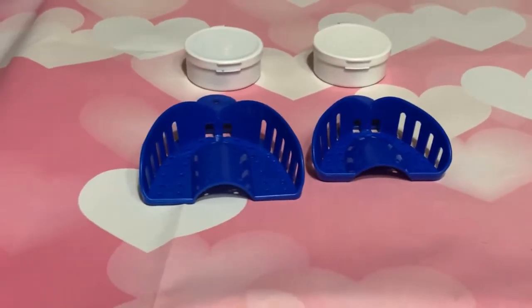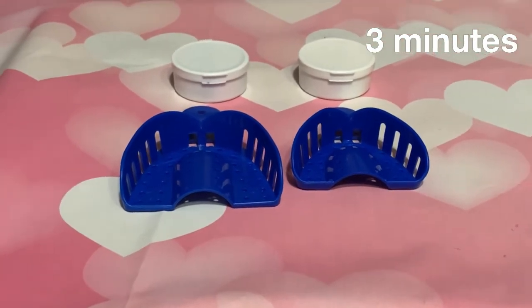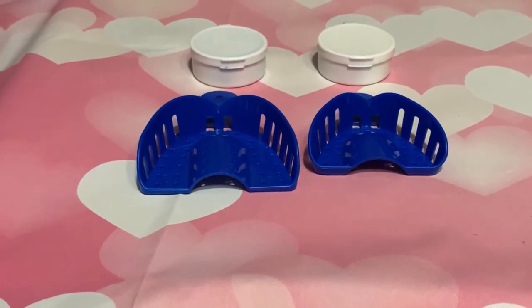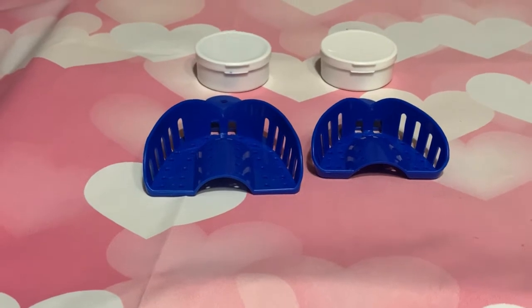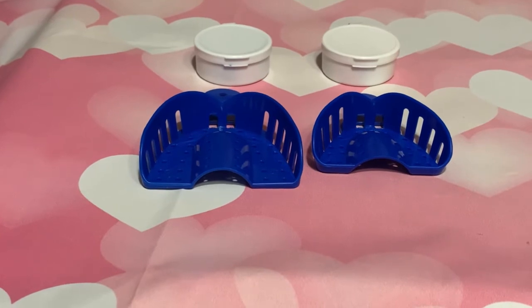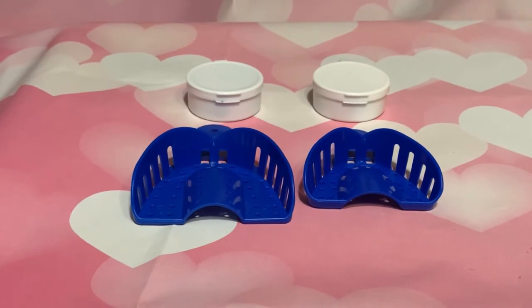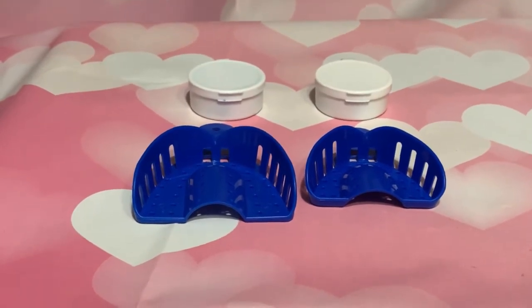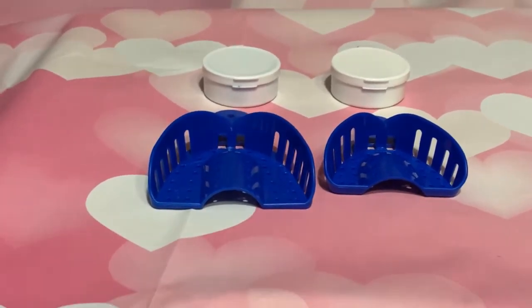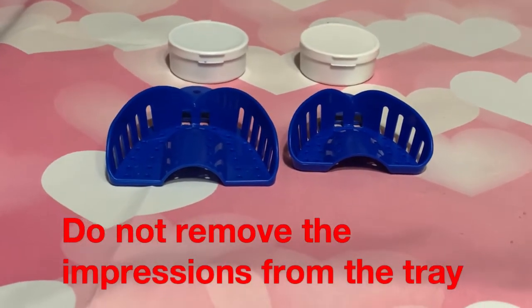And then you're going to leave it in your mouth for 3 minutes. It says that the tray has to stay in your mouth for 3 minutes without even the slightest movement until the putty has set and feels firm to the touch. It says once the putty has set, remove the impression tray from your mouth by using a firm vertical release pull. And then you're going to rinse the tray under cold water to ensure the set. Do not remove the impression from the tray.